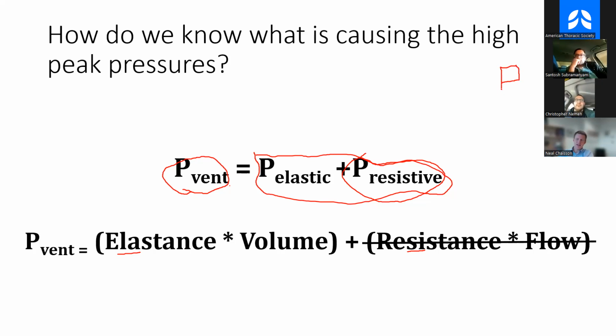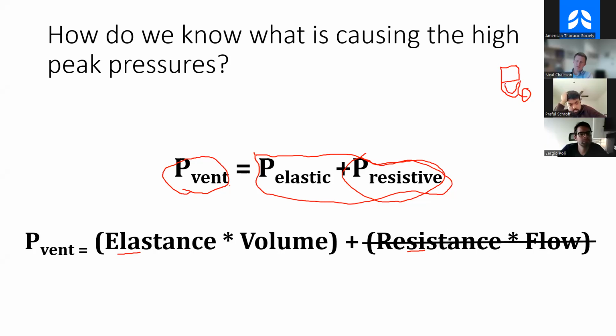So if this is the ventilator, you'll notice on all the ventilators that there's 2 tubes, okay? There's like a white and a blue one, and then here's your ET tube, and here's your patient. And so the flow is going through the tubes like this, back to your ventilator. And the sensor for the ventilator, which is measuring the pressure, is not at the patient's mouth. It's actually right on the return port at the ventilator. So if you have a kink in any of these tubes, or at the ET tube going into the patient's mouth, you're going to have an increased resistance to flow that's picked up by the ventilator, okay?